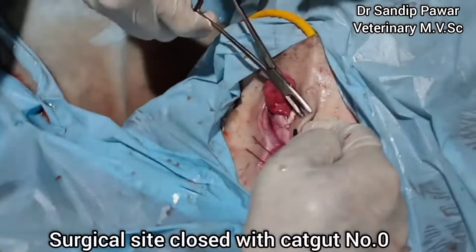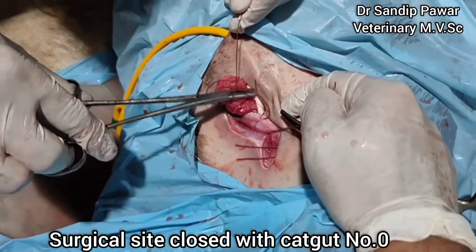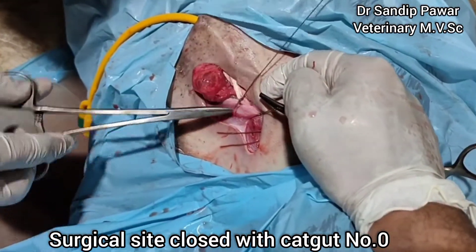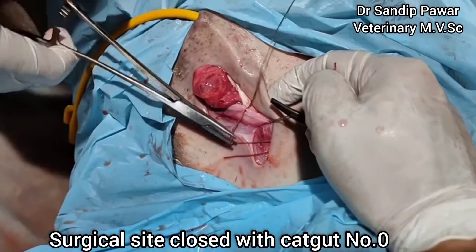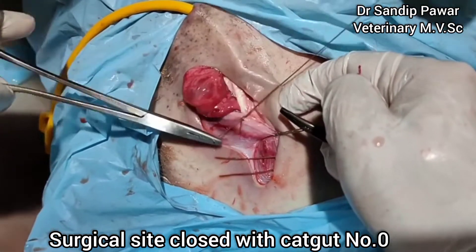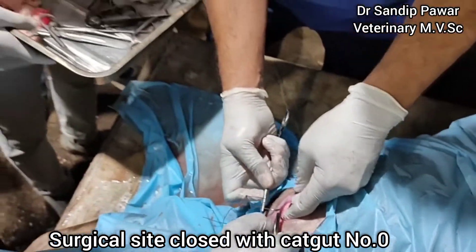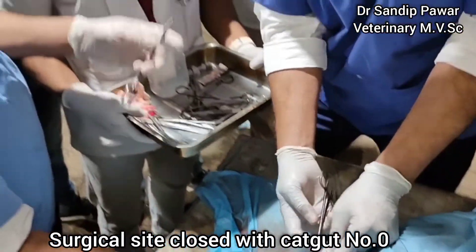Then the surgical site was closed using cat gut number 0 as a suture material.